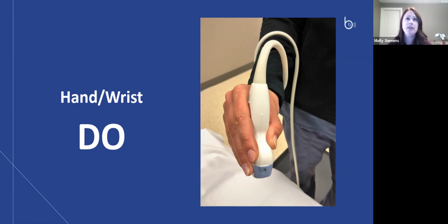If the excessive squeezing is because of patient body habitus, try optimizing your machine settings before getting too far into the protocol, altering the frequency or turning harmonics off or on, and then using an alternative window. Have the patient adjust their position in order to get an easier or shallower window to the anatomy that we are looking at. Lastly, wearing appropriately sized textured gloves can also avoid gripping the transducer too tightly in order to avoid dropping it.